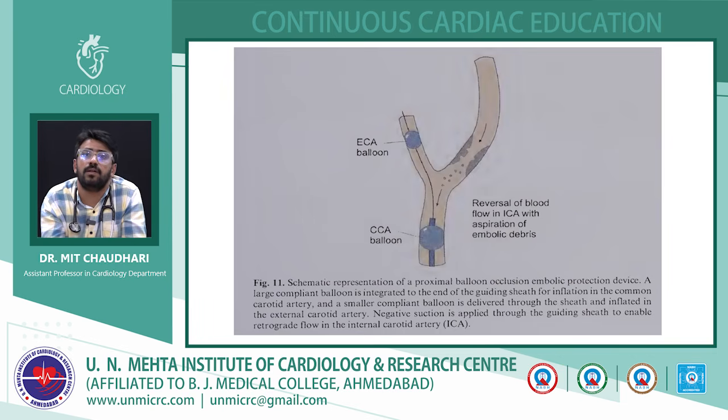And this is the schematic presentation of the proximal balloon occlusion device. Here one balloon is inflated in the external carotid artery, while the proximal balloon is inflated in the distal common carotid artery. So there will be reversal of the flow, or the flow will become stagnant across that particular segment of the internal carotid artery, and you perform the procedure through this device only.